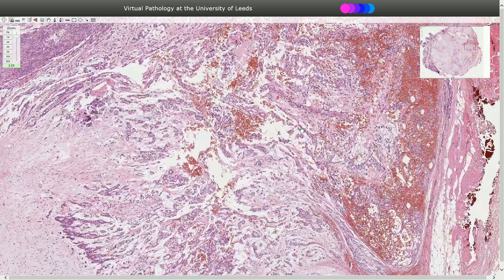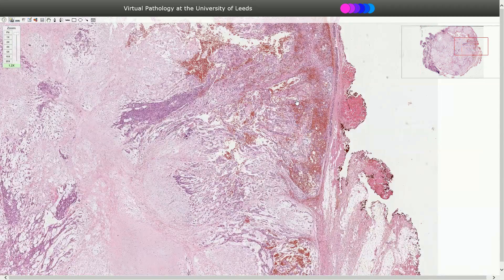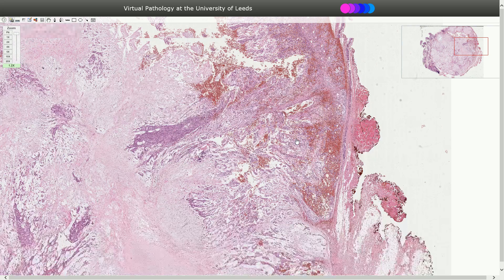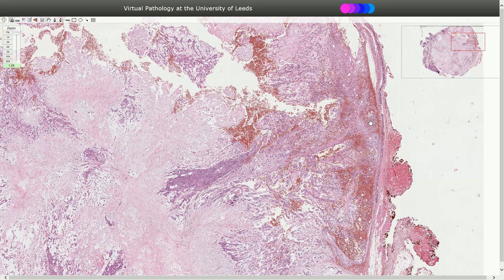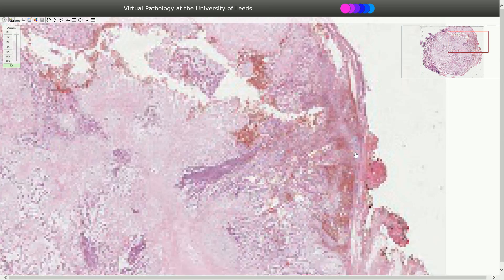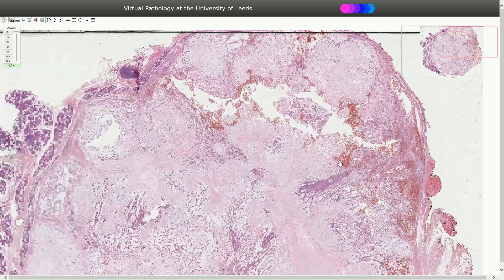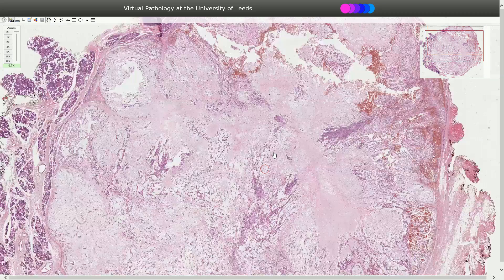Sometimes we can see carcinoma that was transformed from a prior Pleomorphic Adenoma. This tumor is called carcinoma ex Pleomorphic Adenoma, so we need to pay attention and check for this type of transformation. The carcinoma can be seen inside the tumor or associated with infiltration into adjacent structures — carcinoma with infiltration beyond the capsule. But that's not what we see here, so this is a normal benign Pleomorphic Adenoma.